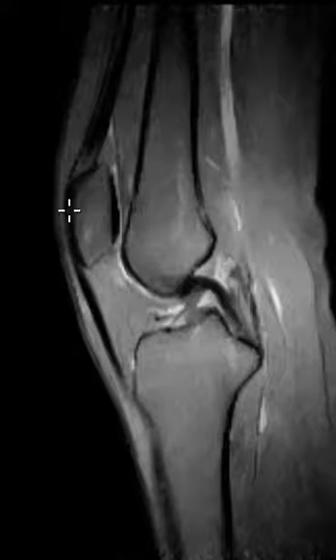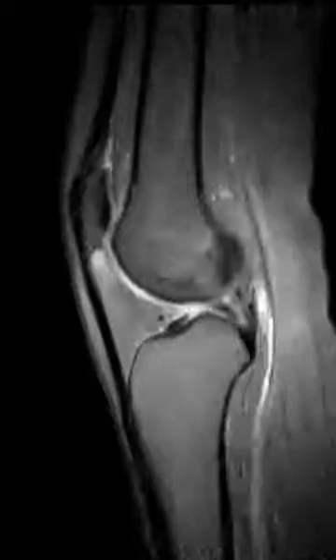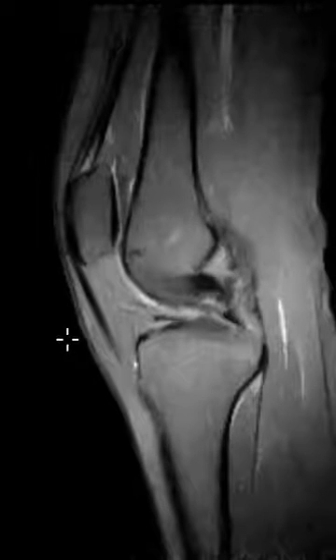So they have patella alta and a little bit of edema from fatty impingement, and this is on the lateral side — I believe this is what's causing their lateral-sided pain. Everything else looks perfectly normal. So: patella alta and fatty impingement.